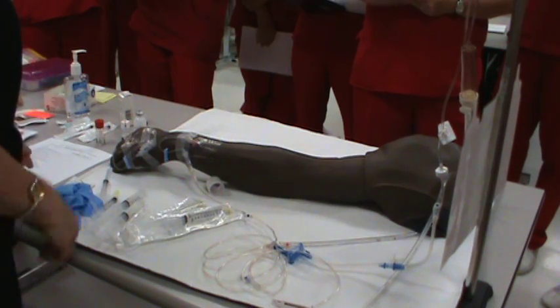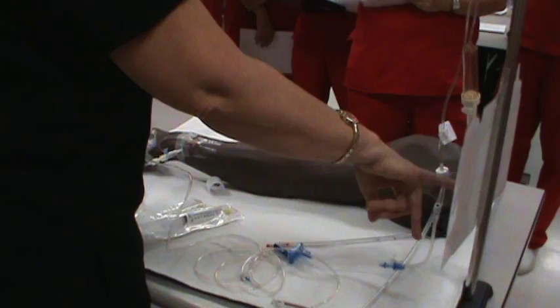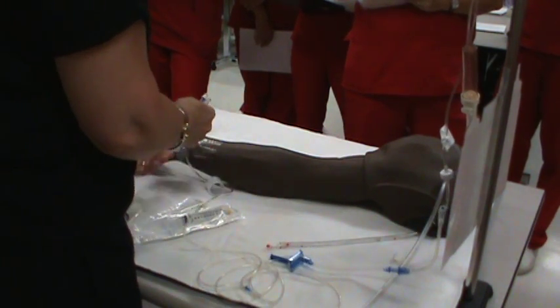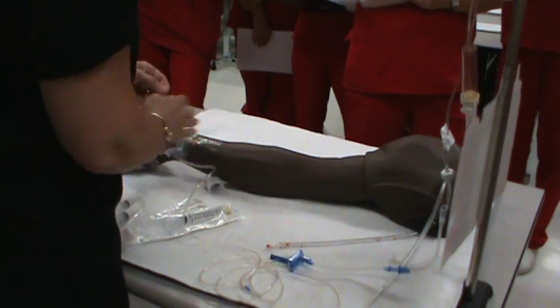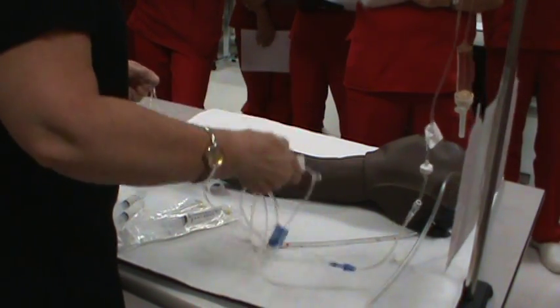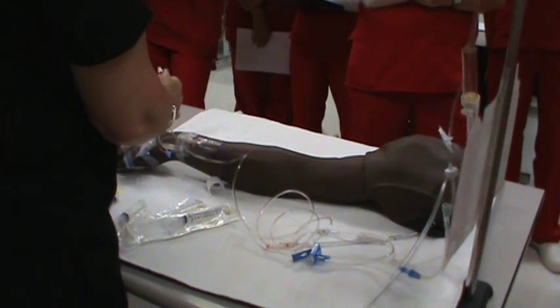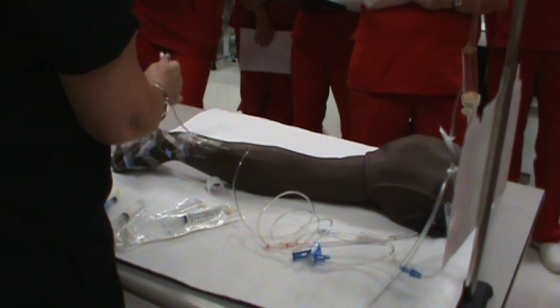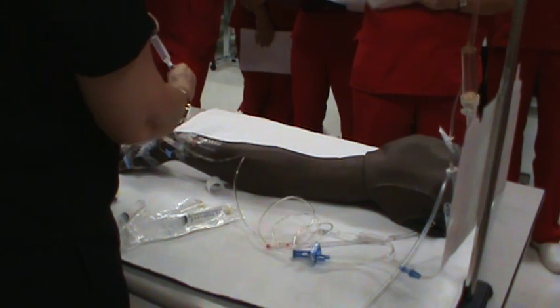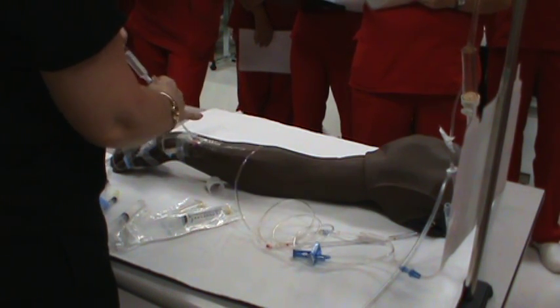Compatible, incompatible, it's just that with the incompatible, you're actually going to stop it. You'd want to break your line. So stop it and occlude. You do your roller clamp, occlude it here. Scrub 30 seconds, attach your 10 ml flush. And you do the whole thing. For an adult, flush it through.